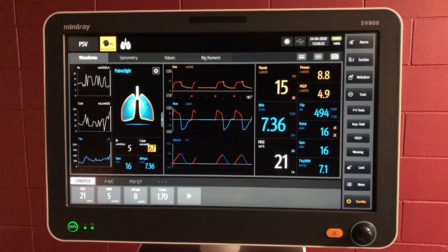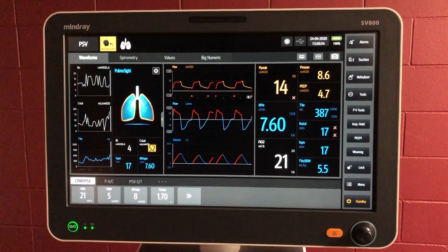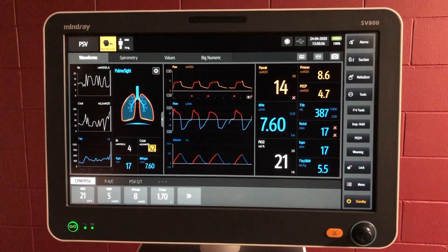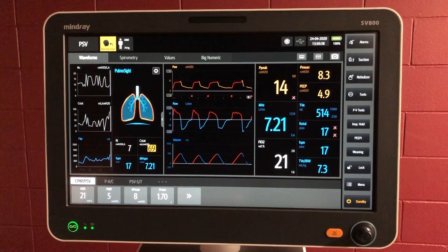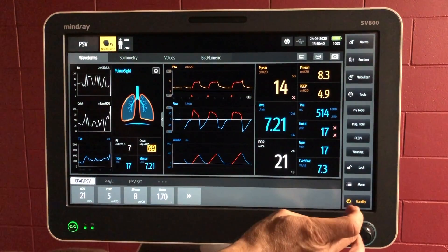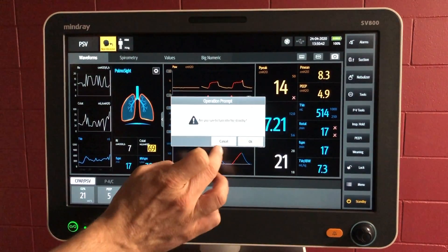When we're ready to intubate, we can put the ventilator onto standby and we can adjust the settings in standby. So we'll put it on standby.